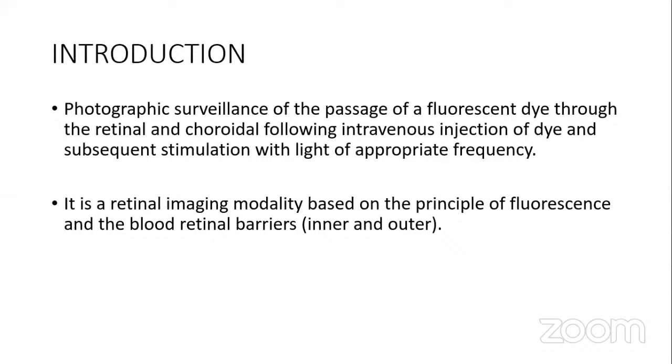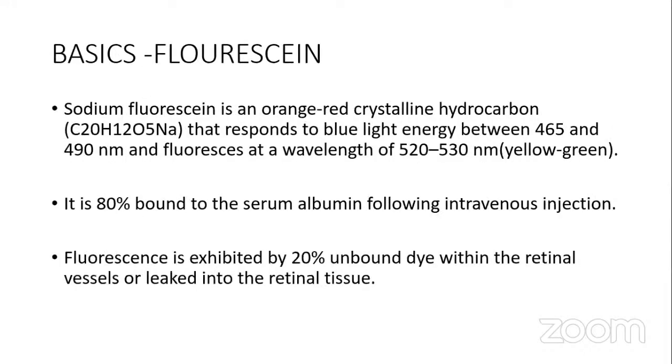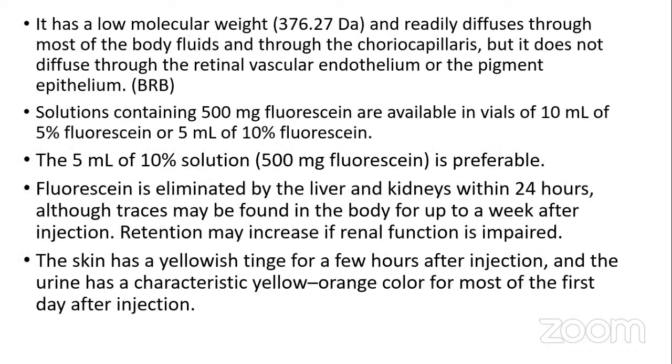The dye is 80% bound, but 20% is free, and that 20% is what responds to the appropriate light wave, 465 to 490 nanometers. The FFA is possible because you expect the dye to be within the vessels.